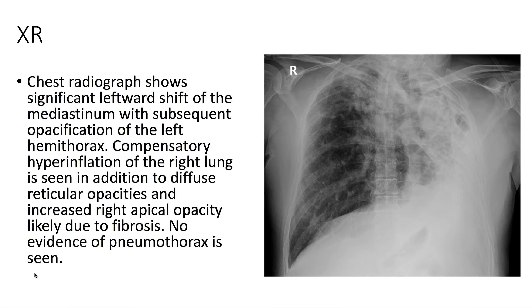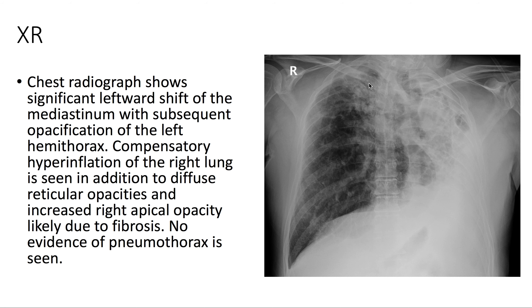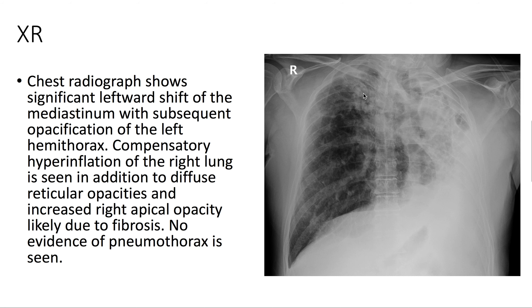On chest x-ray, we see significant leftward shift of the mediastinum with subsequent opacification of the left hemithorax. There's compensatory hyperinflation of the right lung, and we see diffuse reticular opacities, as well as a right apical opacity, likely due to fibrosis.